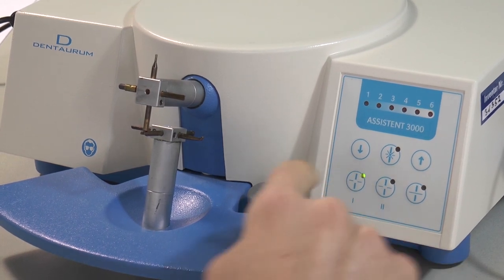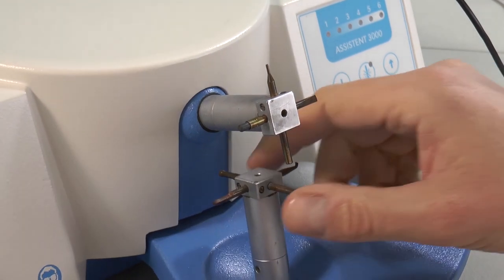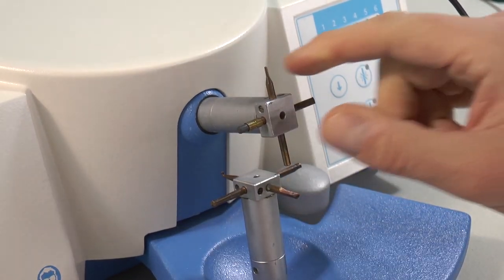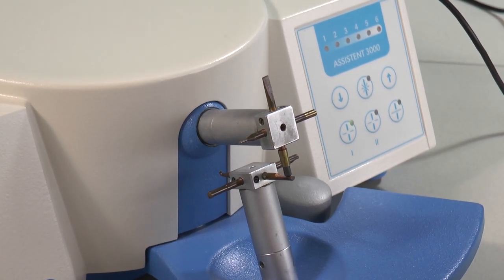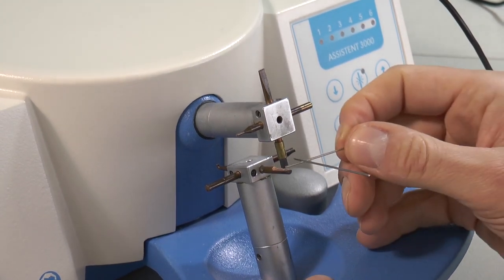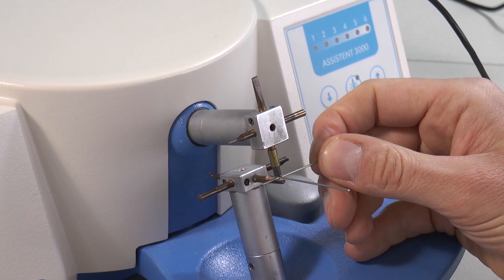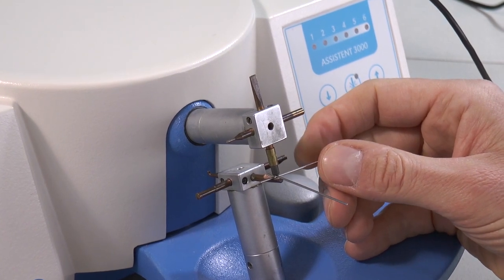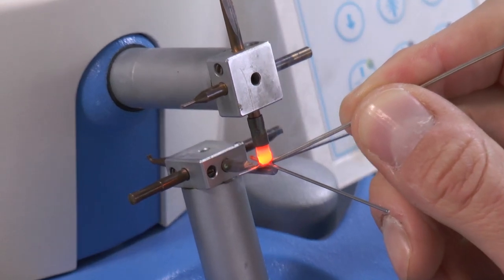Now soldering. Switch on the soldering function — very often level one is the right choice. Now I need the carbon electrode. Put the welded wire in, put some flux on it, or use a solder with flux inside. In this case I use silver solder with integrated flux.